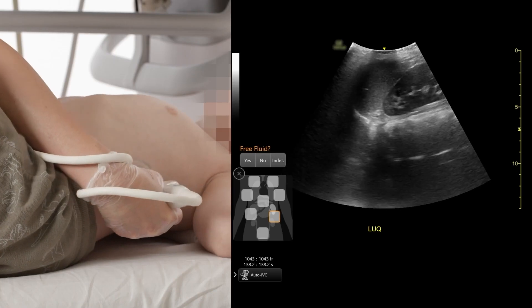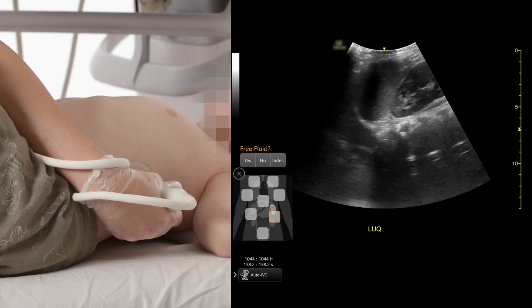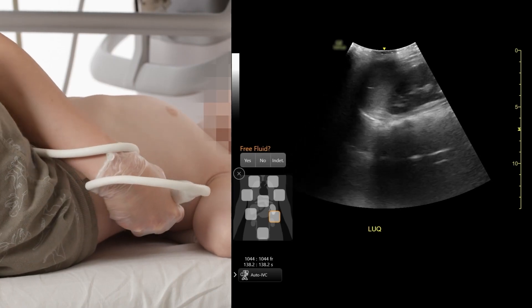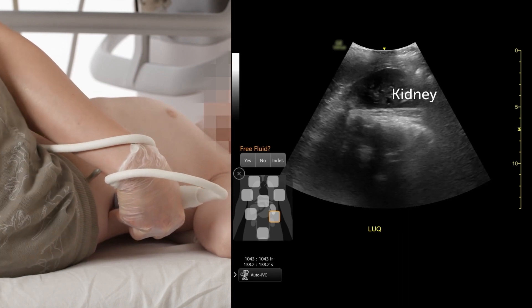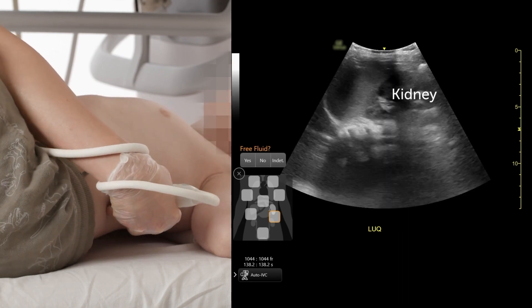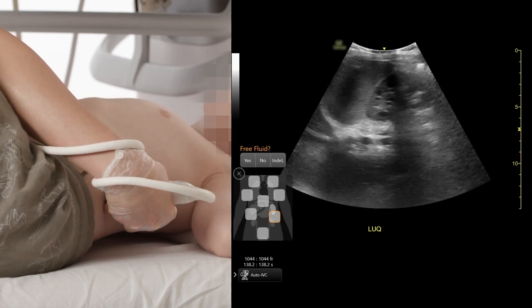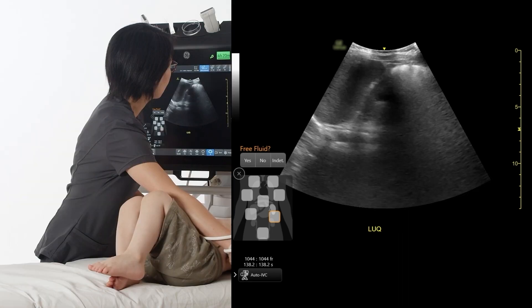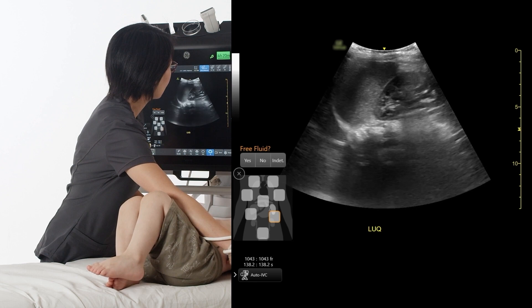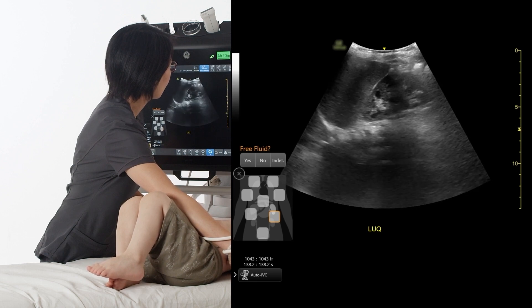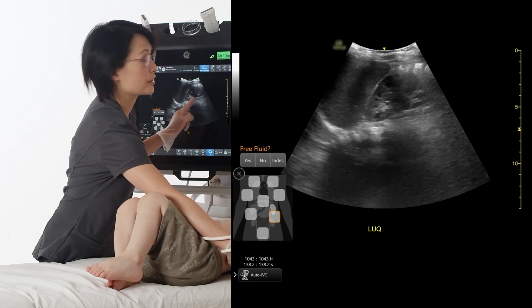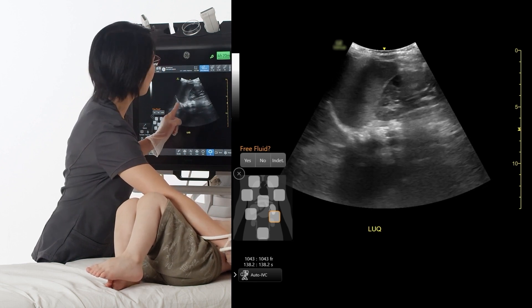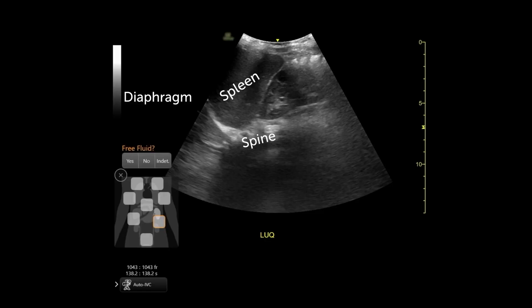Tilt up to look at the diaphragm, and tilt down to look at the inferior area of the kidney. So that's the spleen, that's the kidney, the spine, and the diaphragm.